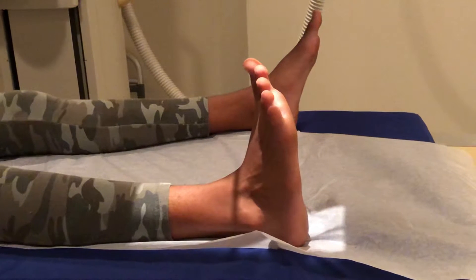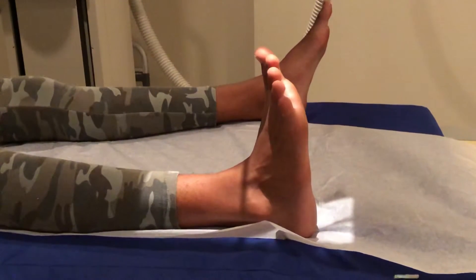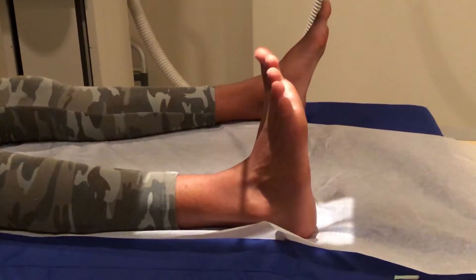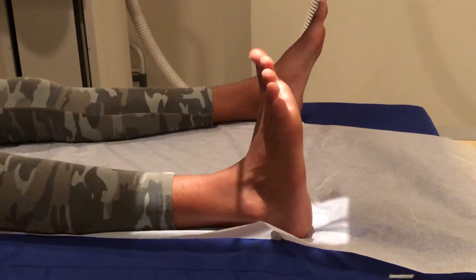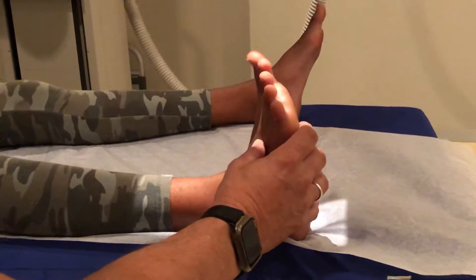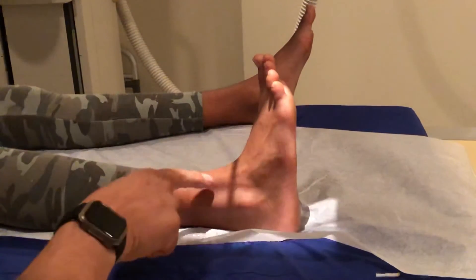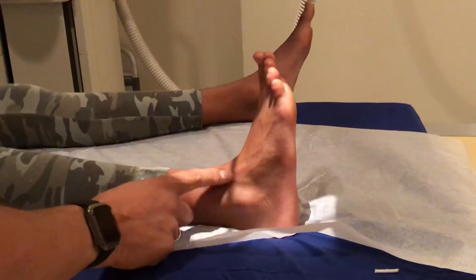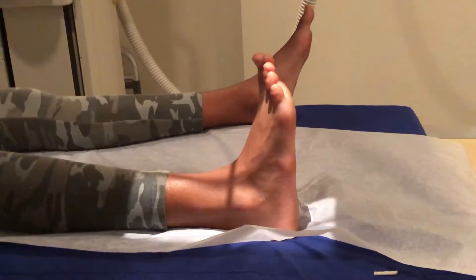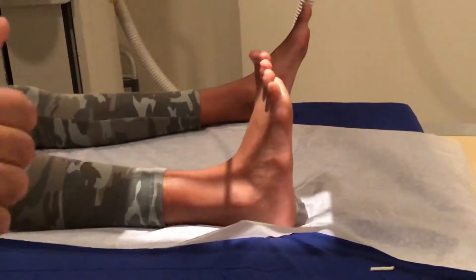The second x-ray is going to be an oblique, and there's a couple different ways to do it, but the way I'm going to show you works for me very well. For the oblique, we are not going to turn the foot — we're going to turn the knee. Turn the knee inwards right until it gets to that junction between the fibula and the tibia, and you shoot. That's the second one.